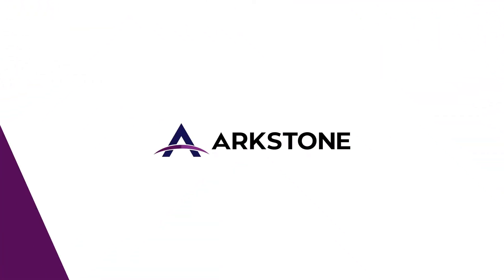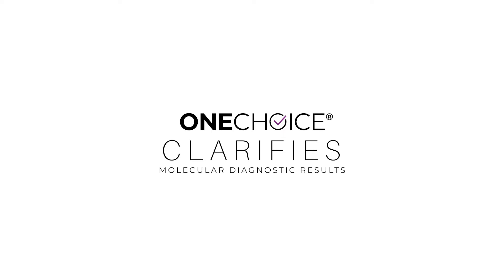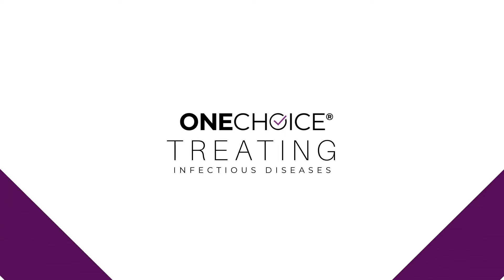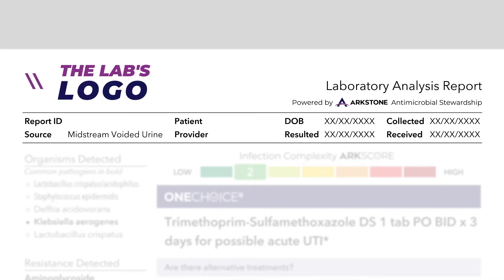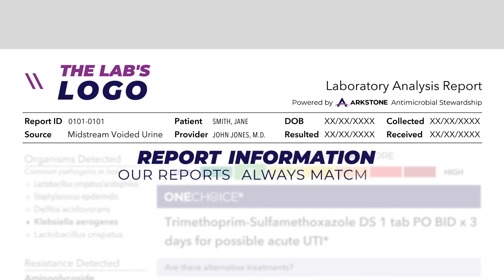Let's take a closer look at how the ArcStone OneChoice report clarifies molecular diagnostic results when treating infectious diseases. The very top of the report features the lab's logo, plus physician and patient identifiers, and the report ID. Each field uses the lab's report information to ensure our reports always match up.